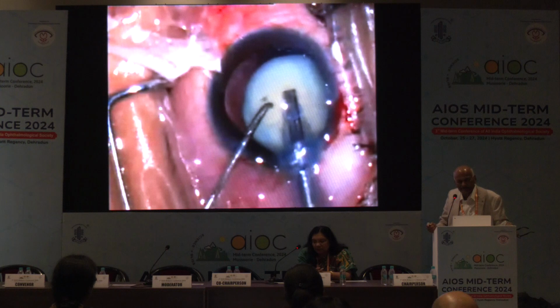Can anybody tell me, by what virtue does the phaco tip penetrate inside the nucleus? Correct. One thing is the support of the posterior part. But to penetrate in, like a drill, what is acting? Electric power.